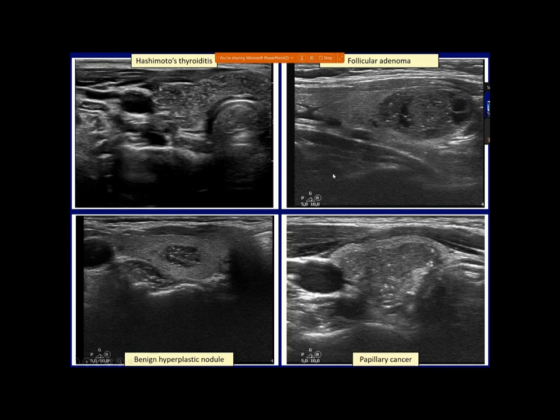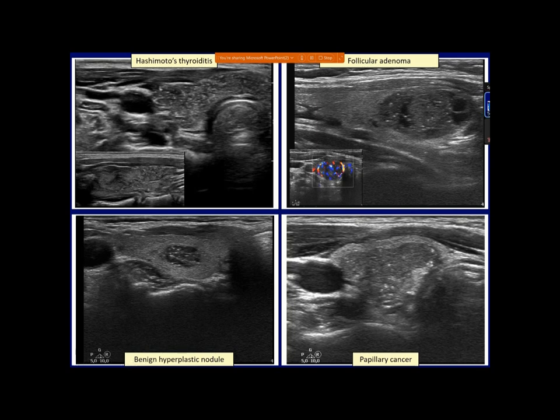I tried to go forward. Yes. So in that case, in the left case, the presentation of the other lobe, that one here in the small insert, a bit decreases our anxiety in the judgment of this pattern, although it would be an unusual situation that a papillary cancer occupied the entire right lobe and great part of the left lobe. The other opportunity, that granules would prevail over lines to such an extent as signs of a proliferation of connective tissue, would also be a rare finding. So these two cases, we can reassure the patient.